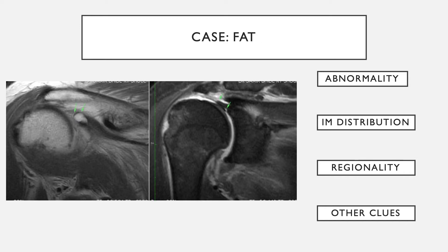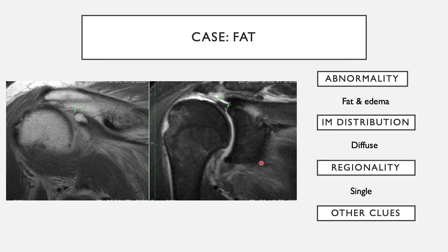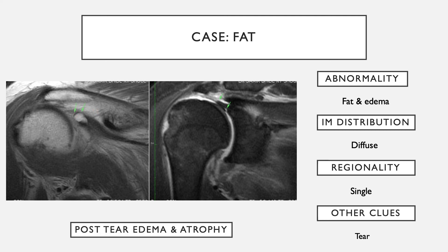Moving to cases of fatty infiltration: in this case, the infraspinatus is much brighter than the teres minor on T1, with a few streaks of muscle tissue but mostly fat. On the corresponding fluid-sensitive fat suppressed image, there is dark signal confirming fat. The abnormality is a combination of fat and edema involving a single muscle. Looking more carefully, there is a tear of the infraspinatus — possibly even a bony avulsion. This is an example of post-tear edema and atrophy of the muscle.